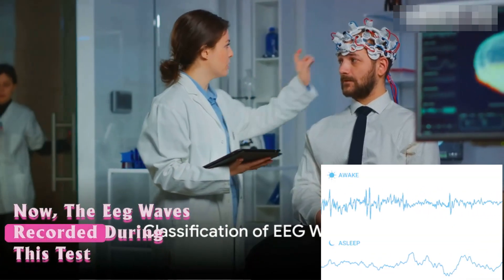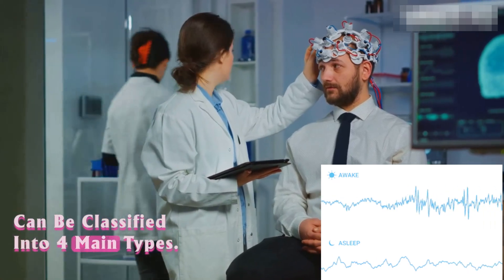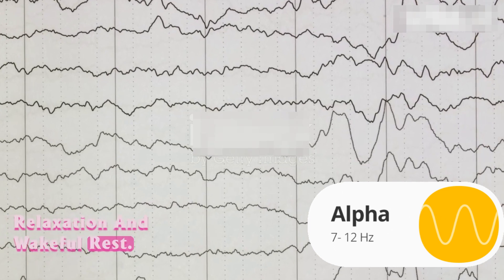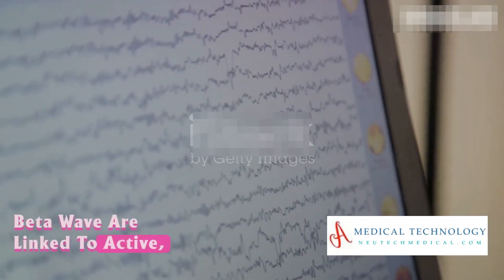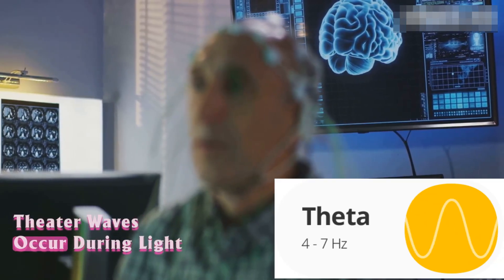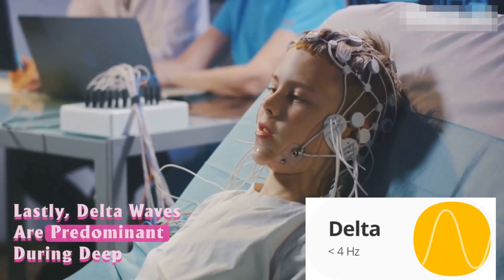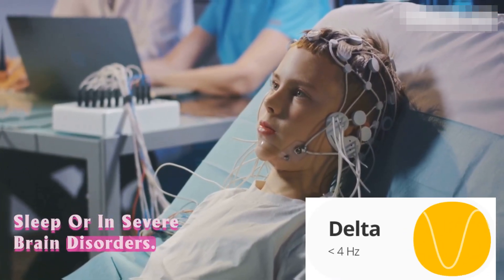The EEG waves recorded during this test can be classified into four main types. Alpha waves are associated with relaxation and wakeful rest. Beta waves are linked to active, alert, and concentrated mental activity. Theta waves occur during light sleep or meditative states. Lastly, delta waves are predominant during deep sleep or in severe brain disorders.